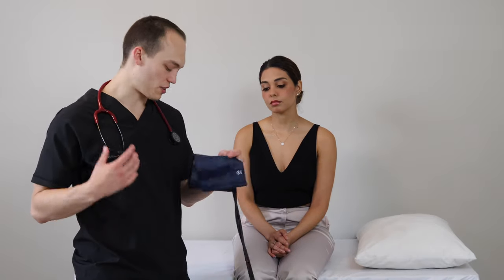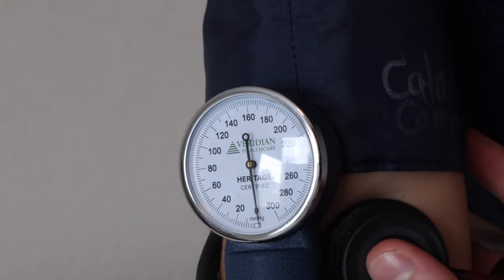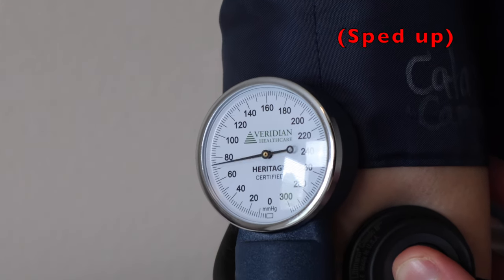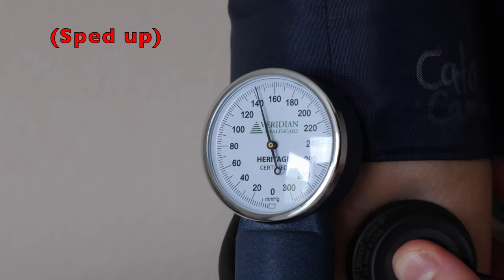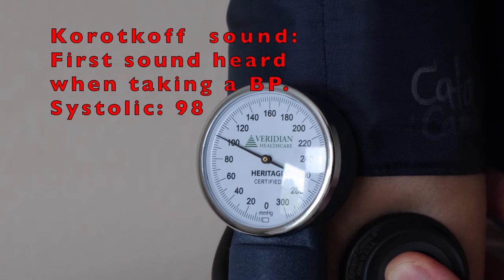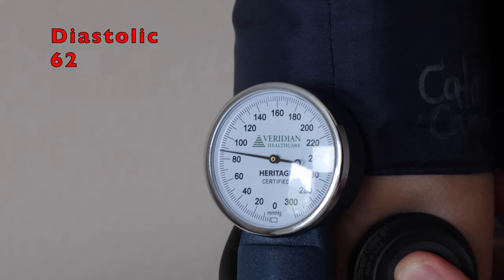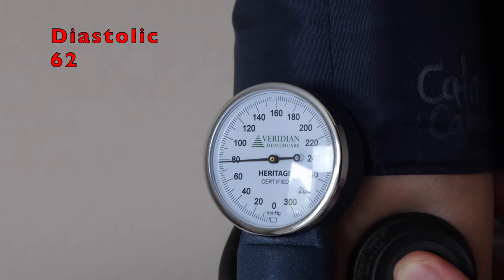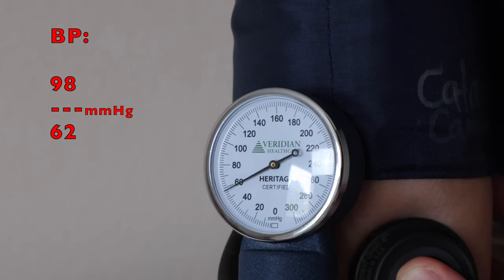Perfect. Now we're going to take a blood pressure — you'll need your blood pressure cuff and a stethoscope. We're going to place the stethoscope and begin inflating the cuff. In nursing school, you'll most certainly learn about Korotkoff sounds — these are the sounds you hear when taking a blood pressure. The first Korotkoff sound you hear is the systolic blood pressure, in this case 98. And the last Korotkoff sound is the diastolic, in this case 62, for a blood pressure of 98 over 62 millimeters of mercury.